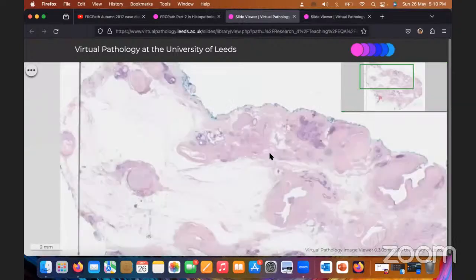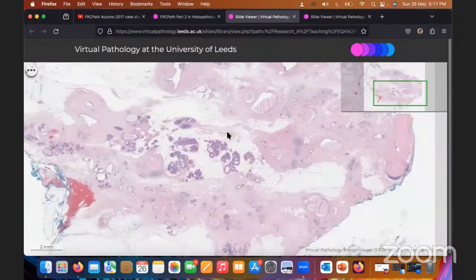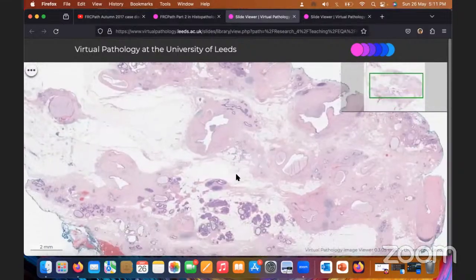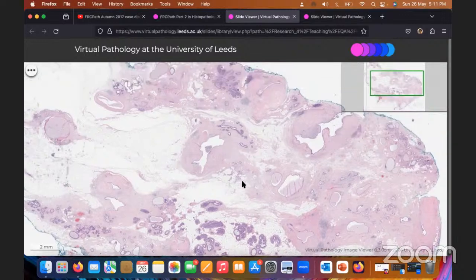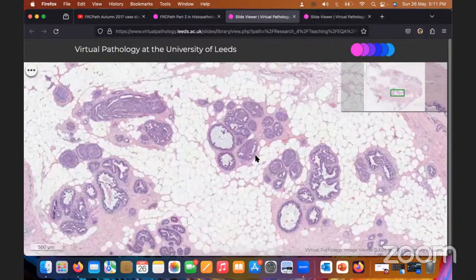So this is an excision many of us are aware of. This is a microdochectomy specimen. And if we see the lesion from the lower magnification, we can see the ducts which are dilated, and there is periductal fibrosis. A few of the TDLU are showing this kind of increased cellularity.